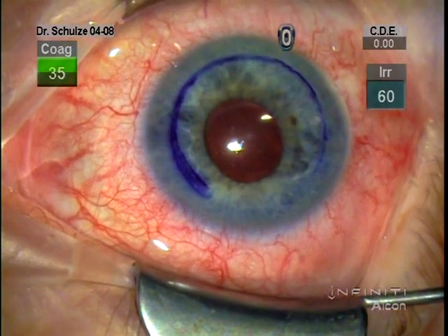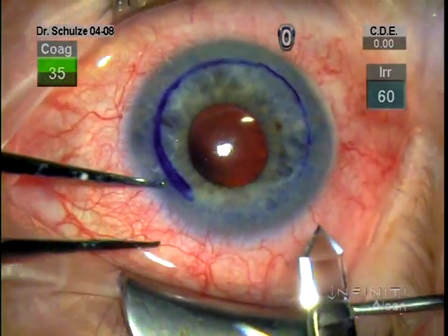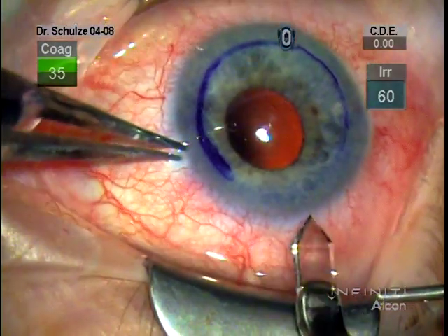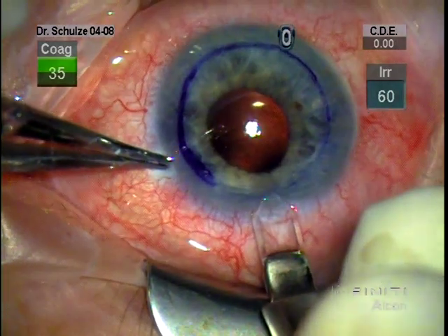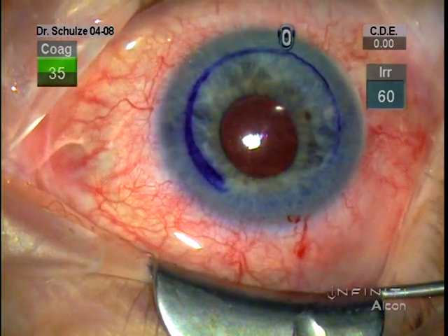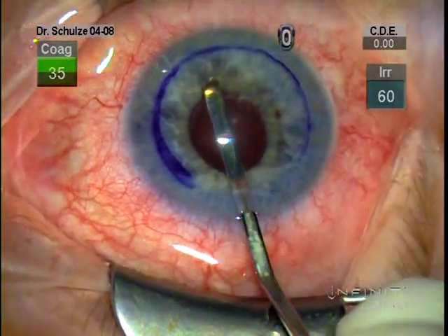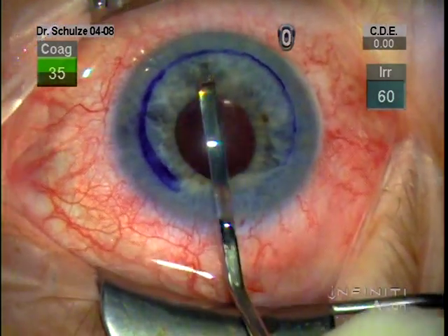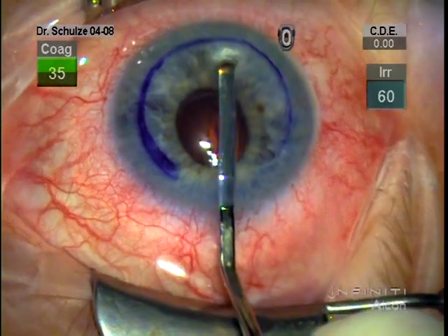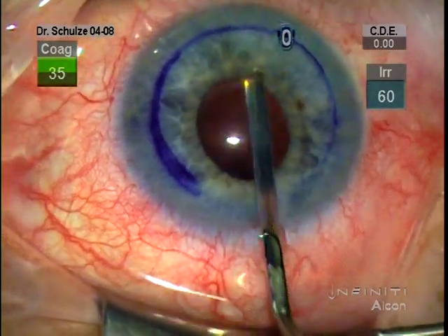After scoring Descemet's membrane, in this case we make a 2.8 millimeter incision at about 12 o'clock with the diamond keratome. With these DSEC procedures, rather than make a shelving incision, I try to make a shorter incision so the internal aspect of the wound doesn't interfere with the margin of the graft. After making this incision, we use a little scraping device to engage the margin of Descemet's where it's been scored previously with the Sinski and gently peel it back. I like to use this scraper because it has a little more surface area and does a nice job peeling.